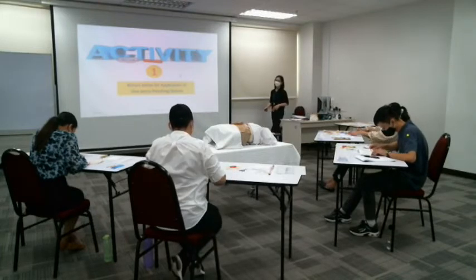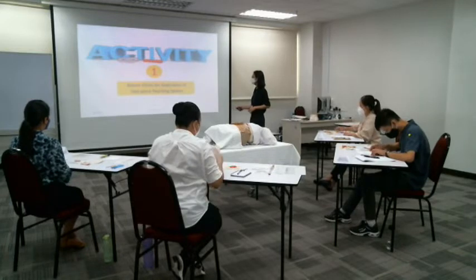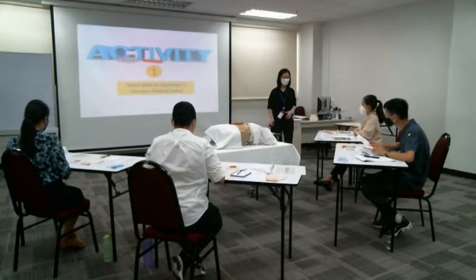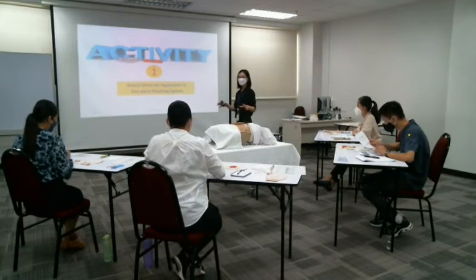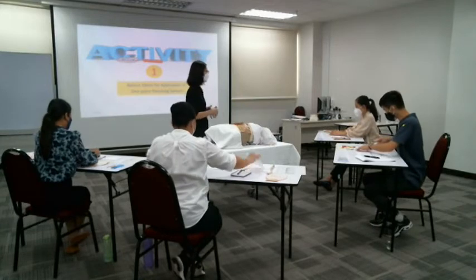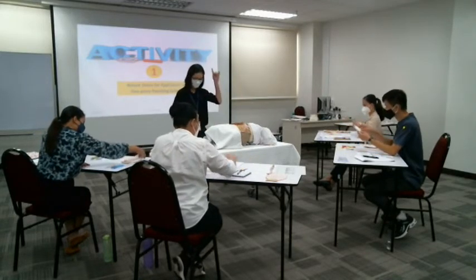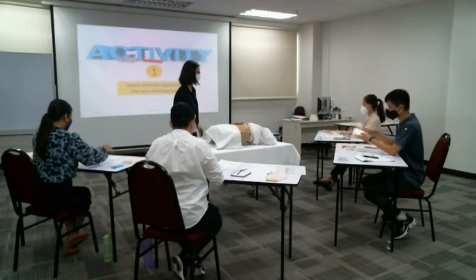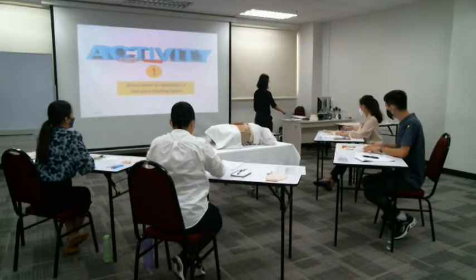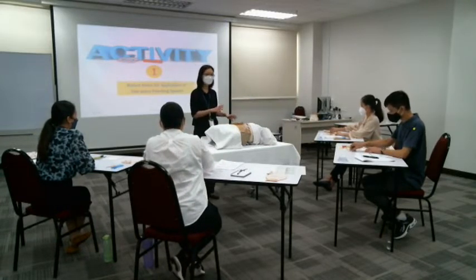Now we come to activity number 1 here. So we need to do a written demo for application of one-piece colostomy system. So you have all your equipment ready. This check, so you are going to do it together with. Okay? So what is the first step? Here. Put this one on this side. Okay, so prepare and gather all your equipment together.